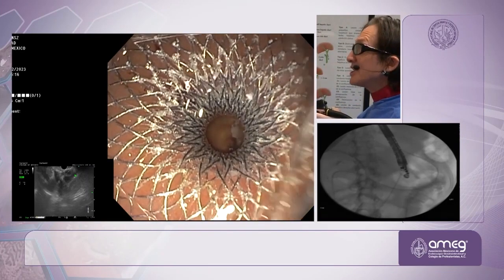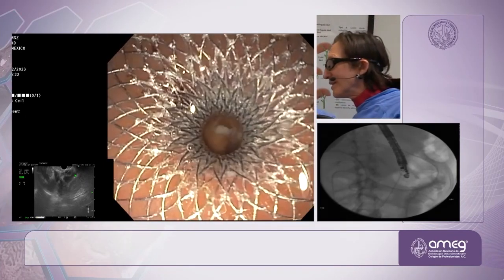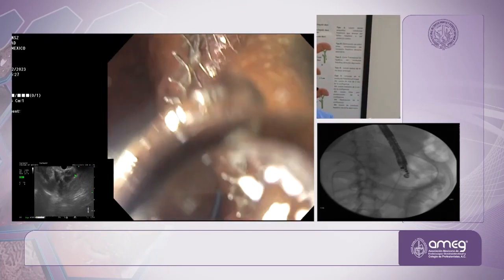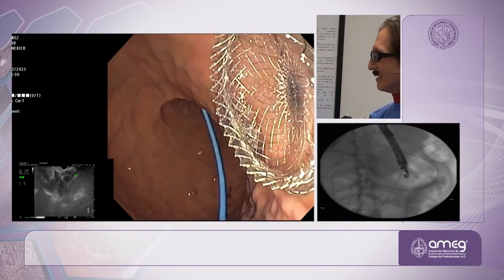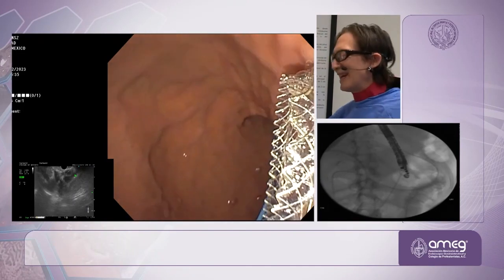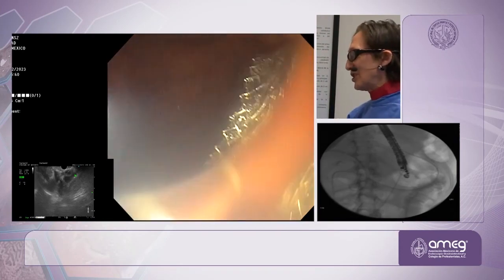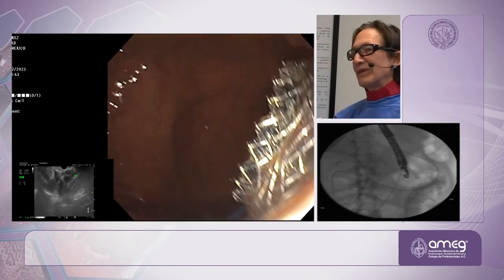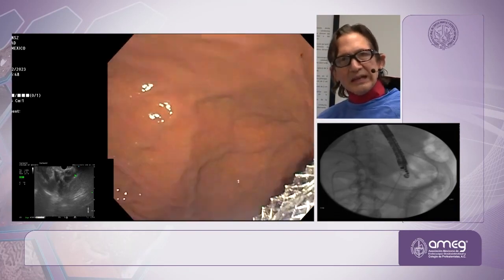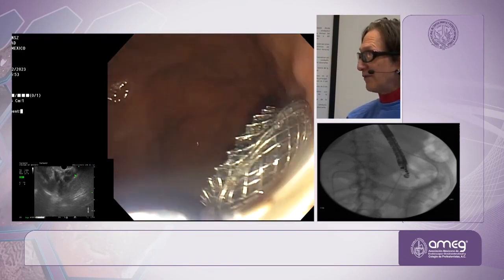But if you see the small bowel, you see the villi? Yes? Or no? Yeah, it's well. Okay, you don't need more. Hot question. Okay. What about EUS-guided comparing to surgical GJ? Well, obviously the surgical is way more invasive. Exactly. So I think if you can do this, it's no different than all of the other endoscopic procedures that have really replaced the surgical alternatives. Okay. So to the degree that this is palliative, if we can palliate this patient and give this patient a good quality of life and ability to eat, look at this.